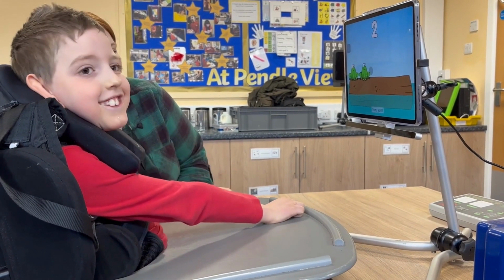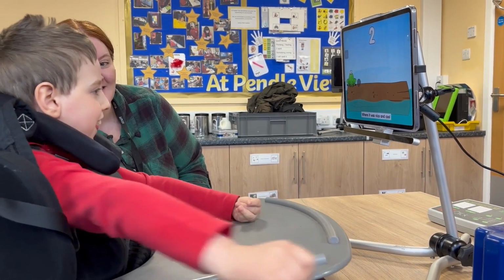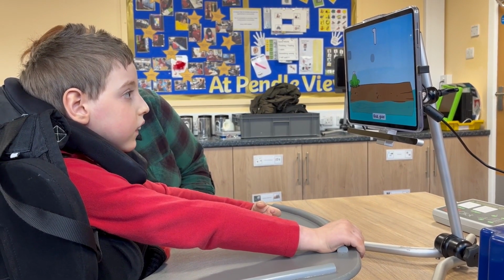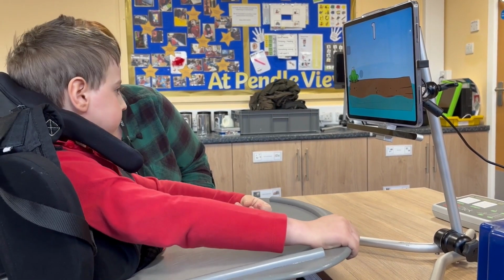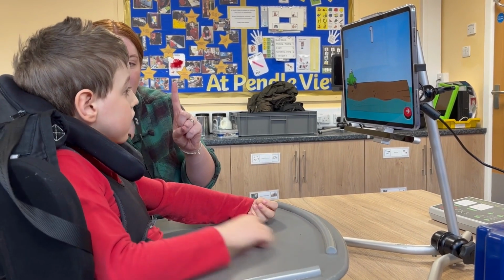So hopefully you can just see on the screen where the mouse cursor is. He's actually focusing right on the frogs there. So he's really quite accurate on eye tracking. He just went up to the number there as it changed. You can see the one frog left on the screen. On now, Harry.